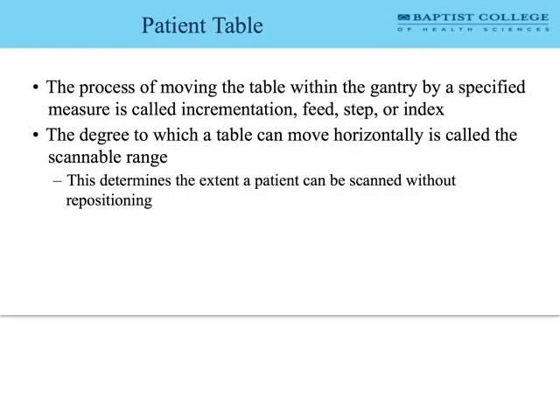I've talked about it quite a bit already, but the big thing for us to understand about this detector electronics for this point in time is on page 20, where it says X-ray photons that strike the detector must be measured and converted to a digital signal to be sent to the computer to be analyzed. That process is going to be handled by a digital acquisition system, a DAS, and the primary moving part that you need to understand most intimately is this analog to digital converter.